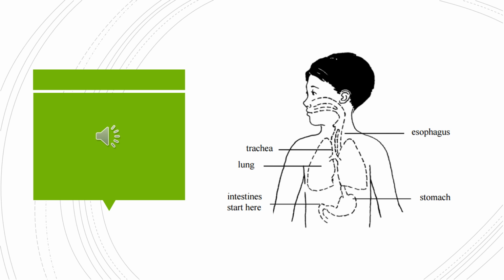Individuals who need tube feeding for a long period of time are typically transitioned to a more permanent gastric feeding tube. The primary advantage of the NG tube is that it's temporary and relatively non-invasive to place, meaning that it can be removed or replaced at any time without surgery.